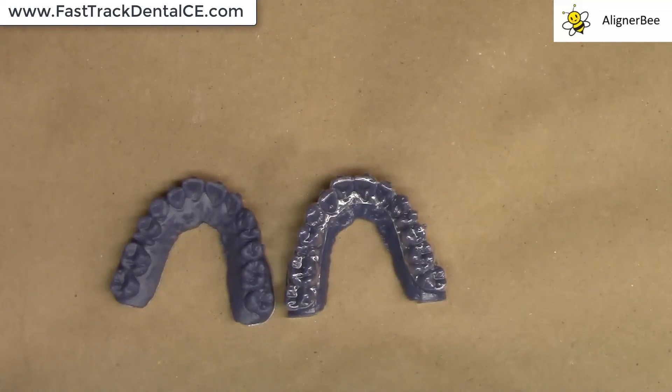This is going to be very helpful, as I can now print more models in the vertical orientation on my SprintRay Pro 3D printer. This is going to really cut down the laboratory time that I have, and that I'm using in 3D printing for my clear aligner treatment.